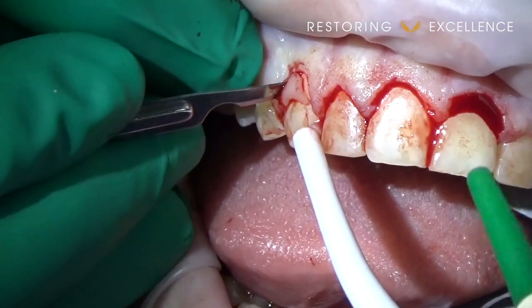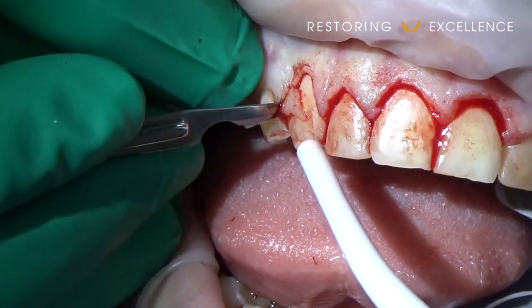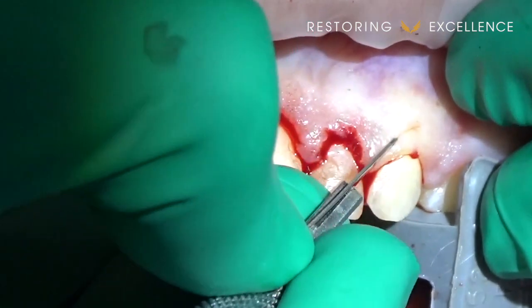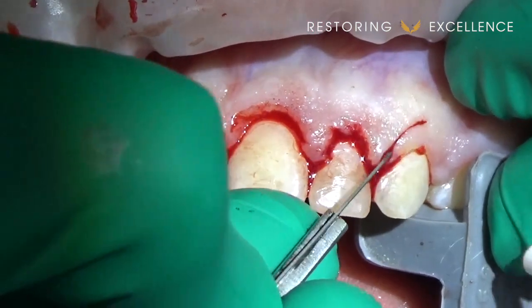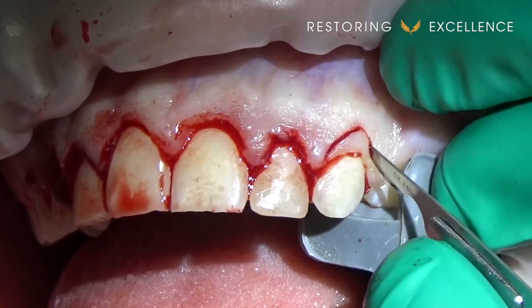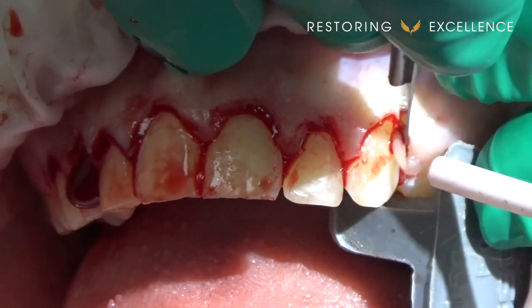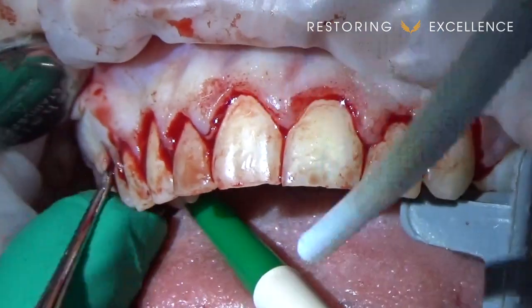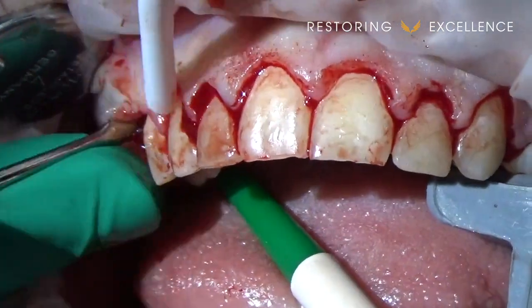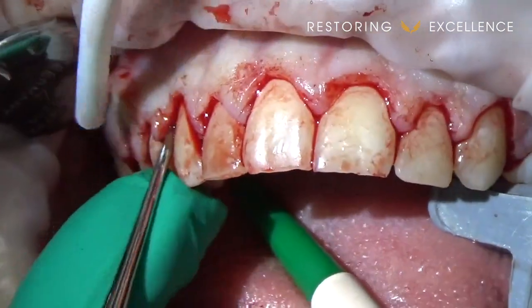The tissue was quite thick and tough here and I was unable to cut it accurately when I had the scalpel angled over for a bevel. So first I'm doing the gingivectomy, then I marked the teeth with pencil and elevated the flap.